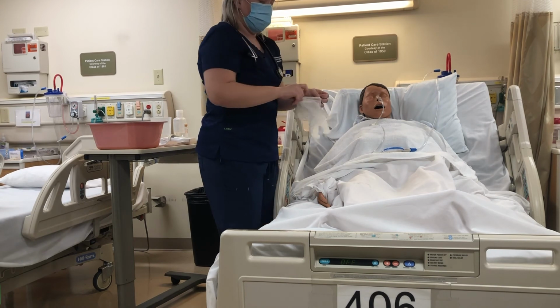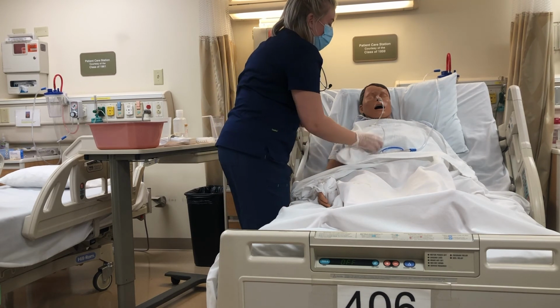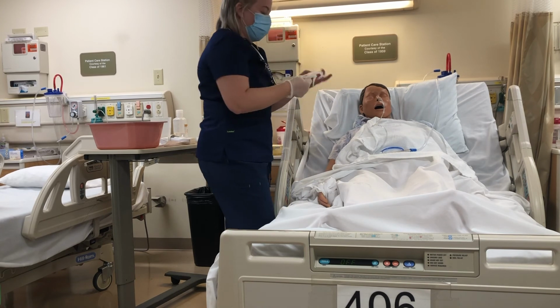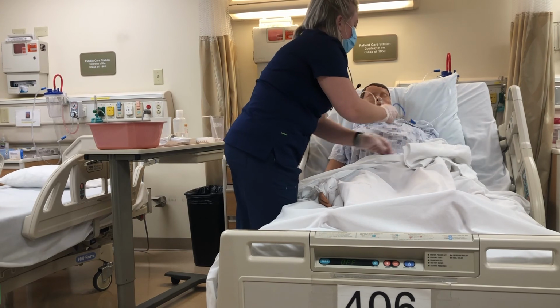Just in case, I'm going to put these gloves back on in case there's anything that got on the patient's towel here. And then I'm going to put a piece of tape on the gown.